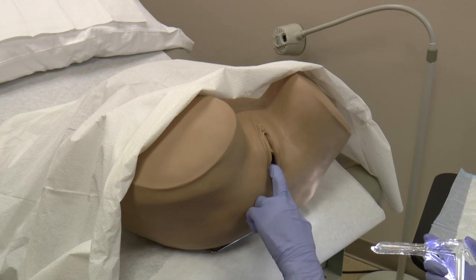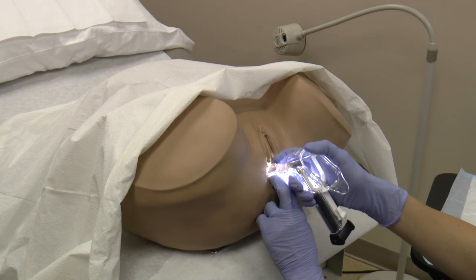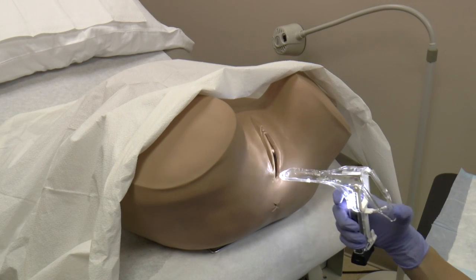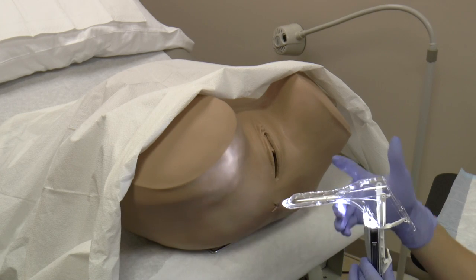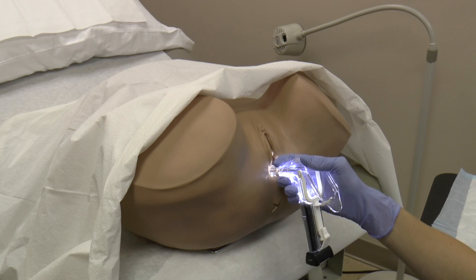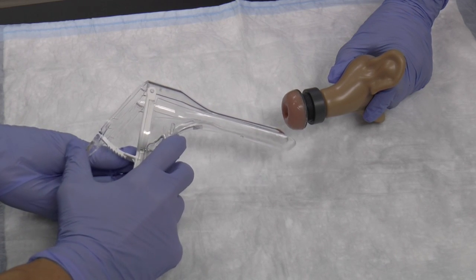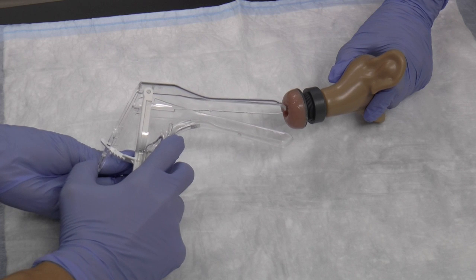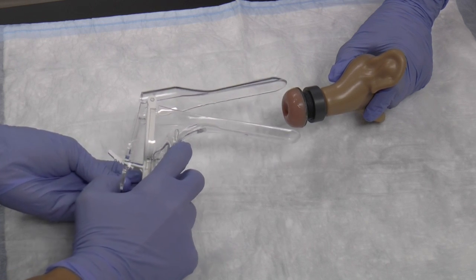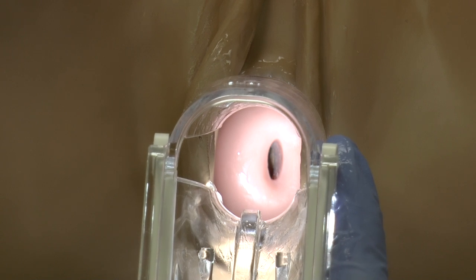You may need to separate the labia to insert the speculum. If you have trouble with the upper blade opening before insertion, try placing both blades between your fingers. The goal is to insert the speculum below the cervix, raise the upper blade, and allow the cervix to drop into view. Gently maneuver the speculum until you can identify the cervix.